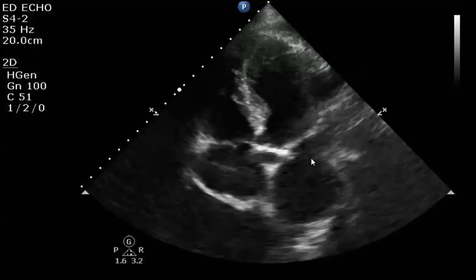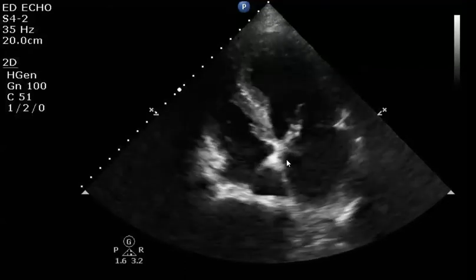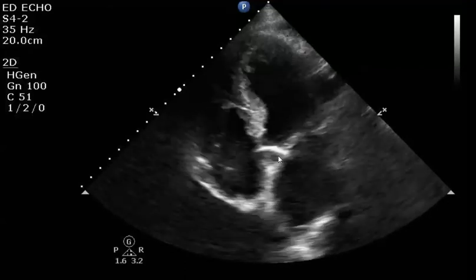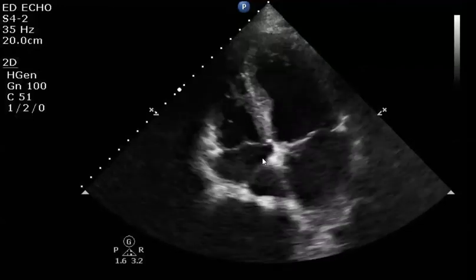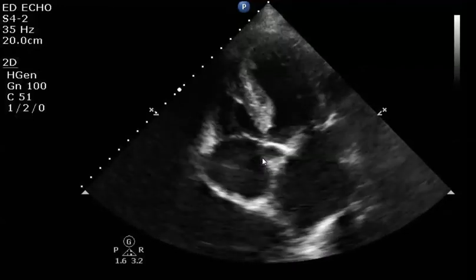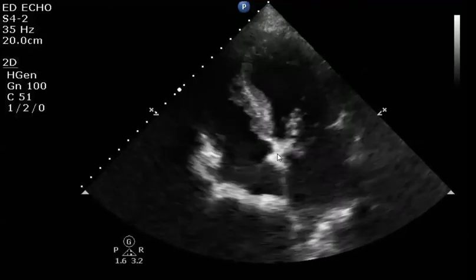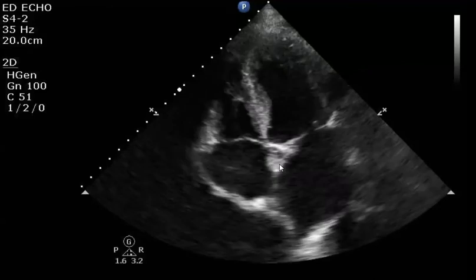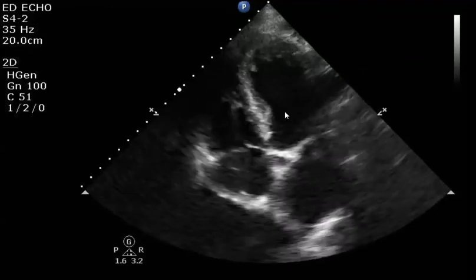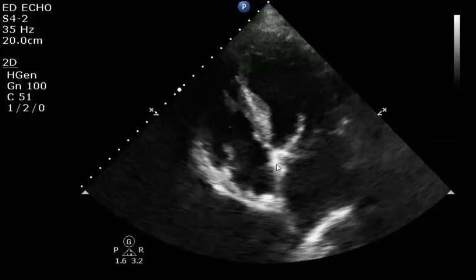other valves do. And in a patient with heart failure or chest pain or syncope, just being able to observe that the valve looks abnormal and isn't visibly moving normally is plenty to go ahead and trigger a focused cardiac workup with a comprehensive echocardiography and involvement of the cardiology service. Assessment of the severity of AS can be difficult and involves determining flow velocities across the valve, and really something better reserved for comprehensive echocardiography.